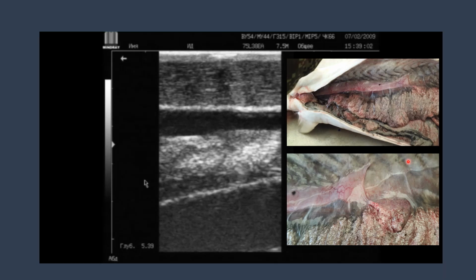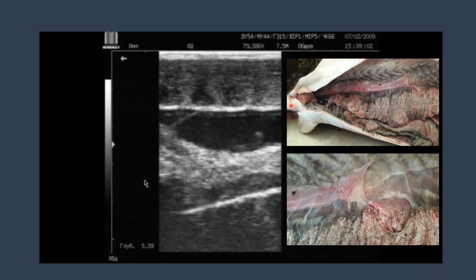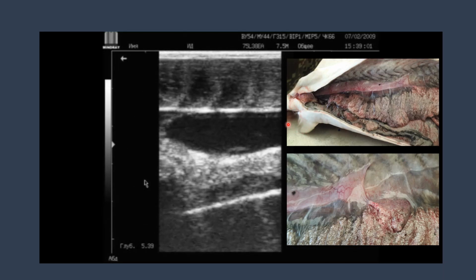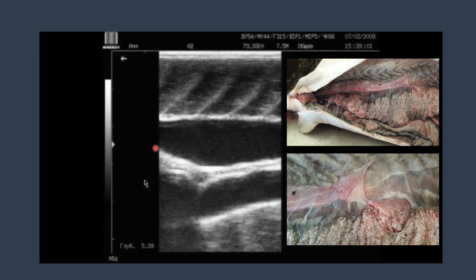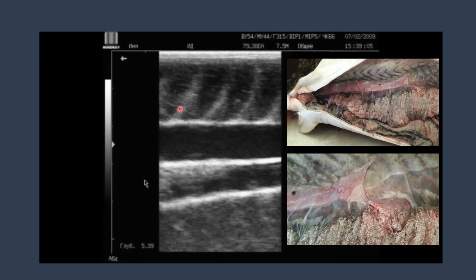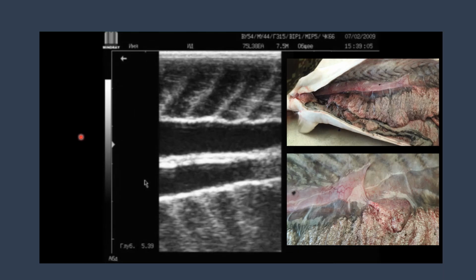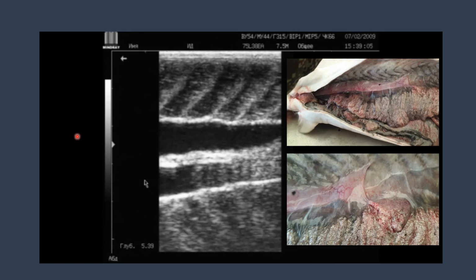At the posterior end, the right and left oviducts close together and open outward with a common genital opening behind the anal opening. In some cases, a small amount of water enters the oviducts during the manipulation of the fish, which absorbs the sound rays and is visualized as elongated black areas. If you observe a picture similar to the one shown in this sonogram, it is advisable either to move the sensor closer to the head or to turn the fish on the other side.